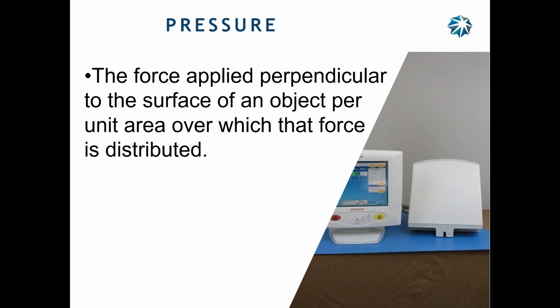Okay? Let's take your garden hose. You turn on the spigot, water comes out. Is that pressure? No. Pressure is behind it. It's the release of pressure that you're seeing. Okay? It's the release of pressure. Pressure is in the pipes behind your open spigot. That's where the pressure's at.